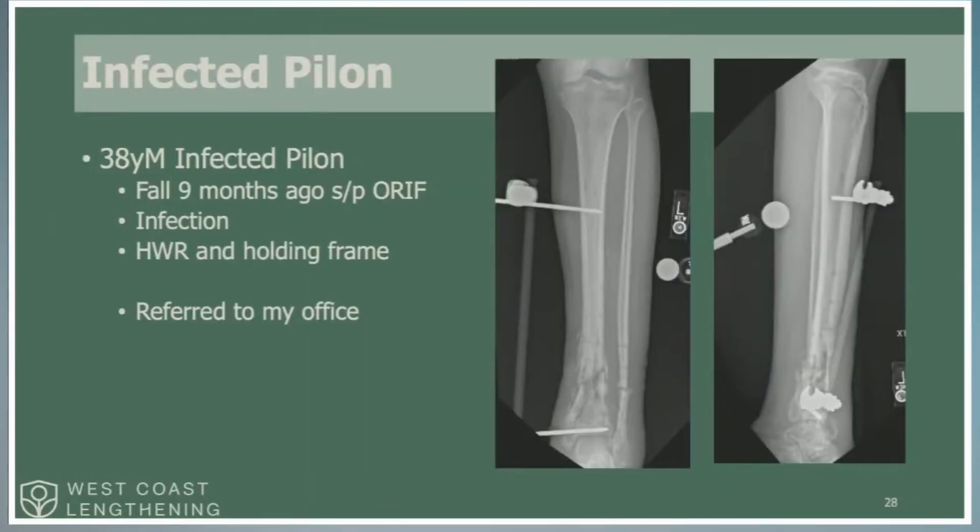All right, here we go. This is getting even more advanced. So 38-year-old infected pilon. This is how he showed up to my clinic. Osteomyelitis here. Had prior infection, hardware removal. Prior surgeon cleaned him out, but he was still draining. Had an open wound too.